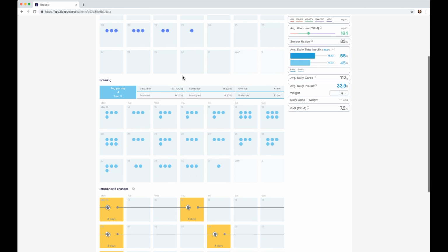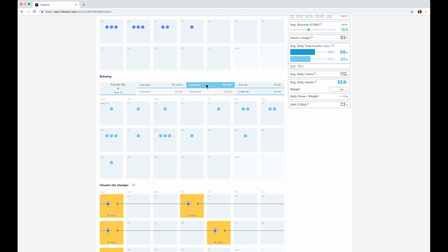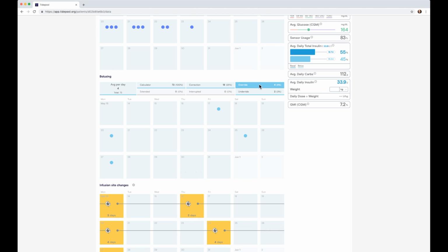Moving down the page, we have our bolus section. This is all data coming off the insulin pump. We have a bunch of different filters within this section, so you can identify the number of times that a bolus calculator was used, in this case 100%. Nice work, James. You can see how often a correction was issued with the bolus, how often a patient requested more insulin than a bolus calculator recommended, in this case we call that a bolus override, or how often a patient requested less insulin than a bolus calculator recommended, which is considered a bolus underride.